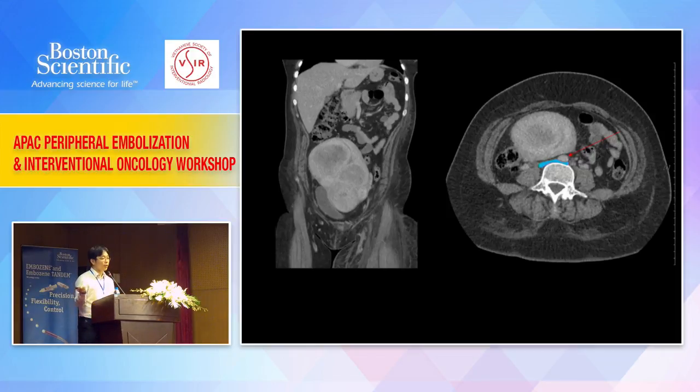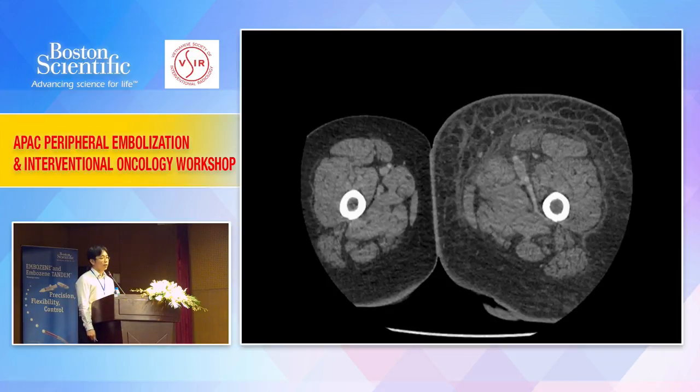So anyway, you can see from the blue color how squashed your vessels are. But you realize that your arteries never get squashed, no matter how big your mass is. Okay, the arteries never get squashed. I've never seen arteries getting squashed. And this patient obviously has very bad lymphedema on the left side, I mean, very bad subcutaneous edema on the left side. So you can listen to what the medical people want to recommend, which is to start anticoagulation for 6 months. But I don't think this patient can even tolerate this for 6 weeks or even 6 days.